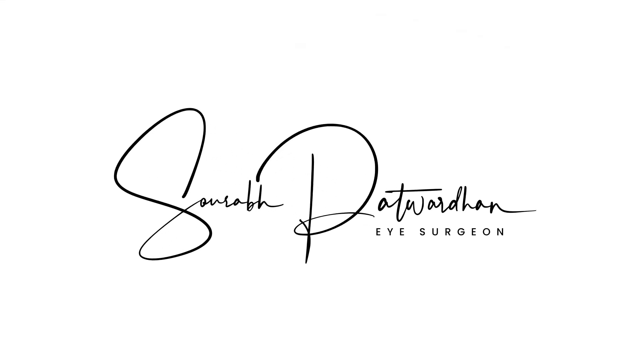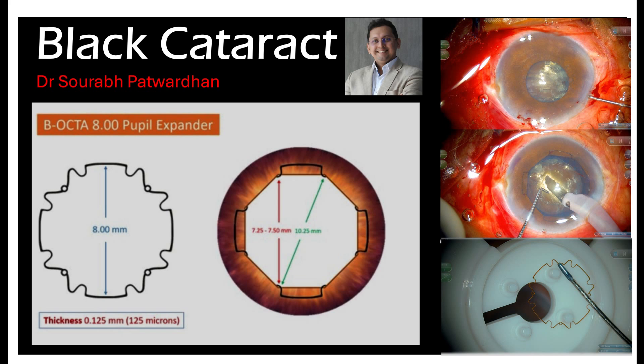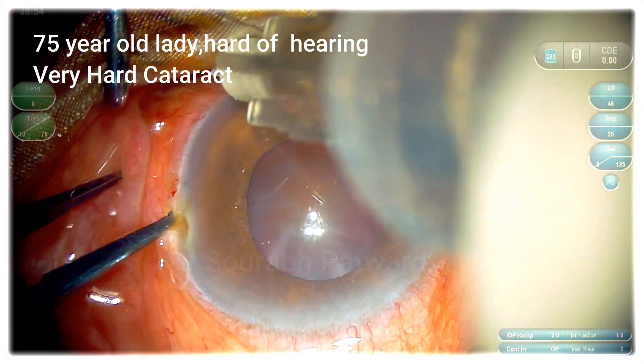This is going to be one amazing video. Just watch it thoroughly and you will enjoy it — you will learn a lot of small minor details. This is a 75-year-old lady, hard of hearing, with a very hard cataract as you can see.